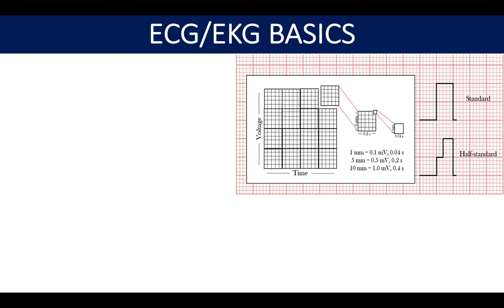Today we're going to be talking about ECG and EKG basics. In order to start with ECG, we need to learn how to interpret the graph. On the graph, the x-axis represents time and the y-axis represents voltage.